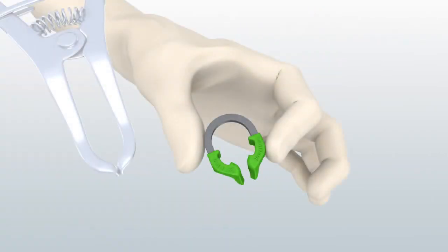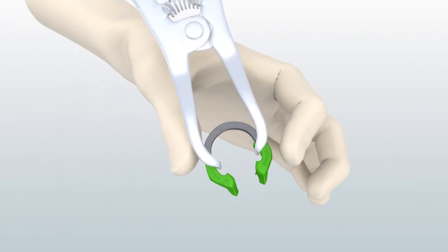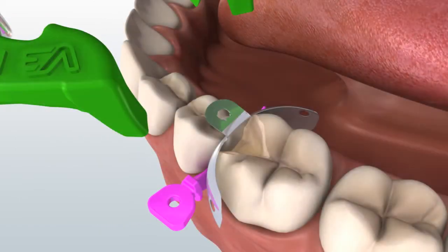Here, the assistant passes the forceps with the V3 ring safely locked in. Be careful not to overexpand the V3 spring. Place the V3 ring using a finger rest to support the forceps. Take your time over this step, as rushing can dislodge the matrix or wedge.